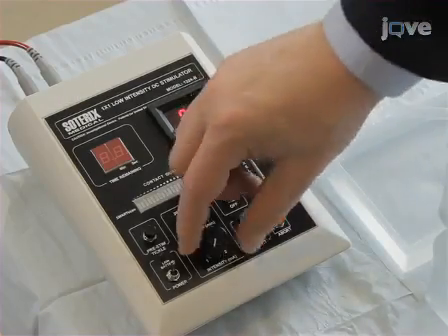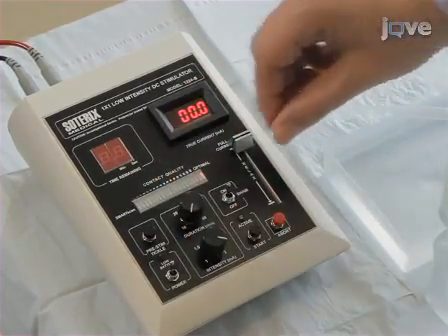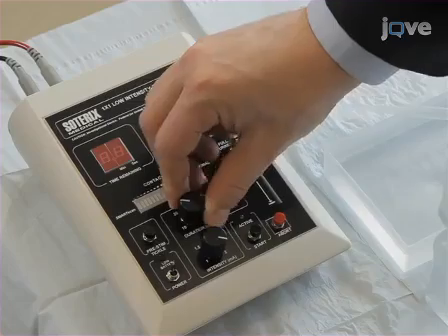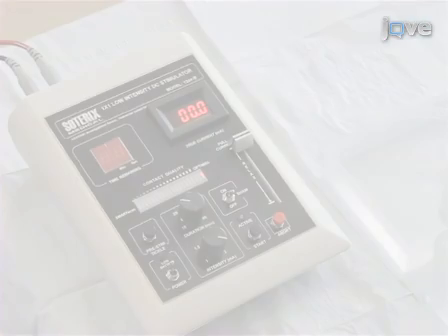Adjust the settings for stimulation, including the intensity, time, and if applicable to your device, the sham condition setting. Here, a reliable setting for pain treatment is used, stimulation at 2.0 mA for 20 minutes.